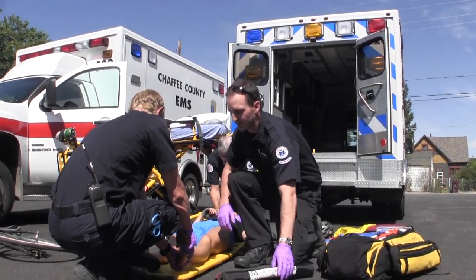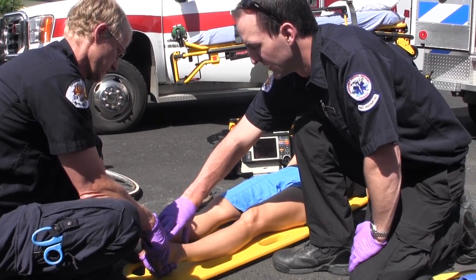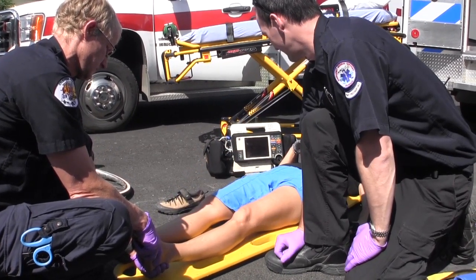Introducing the Slishman Traction Splint, or STS, by Rescue Essentials — an innovative traction device that solves many of the problems encountered with other traction splints.